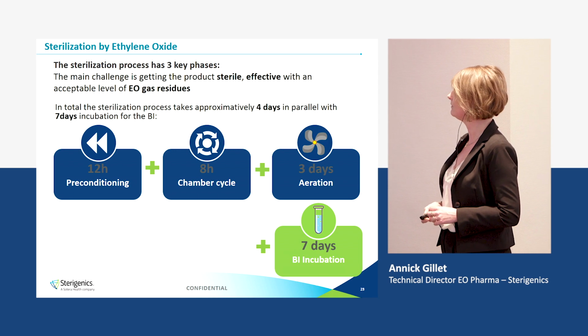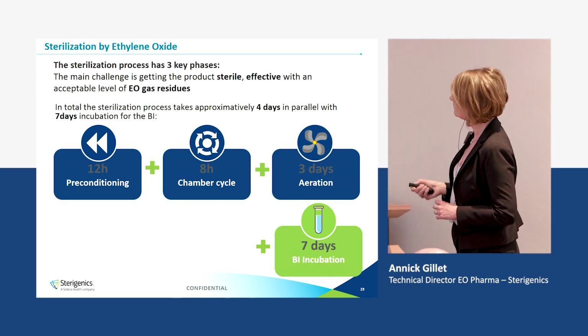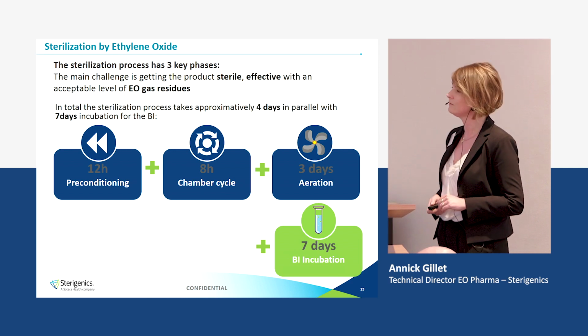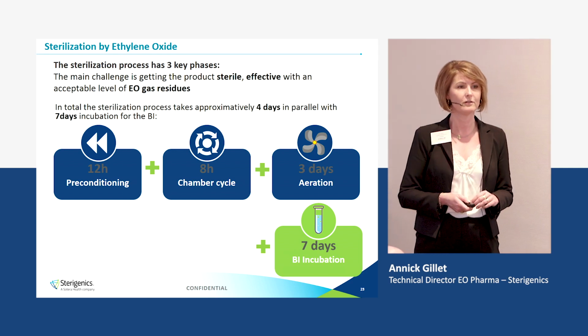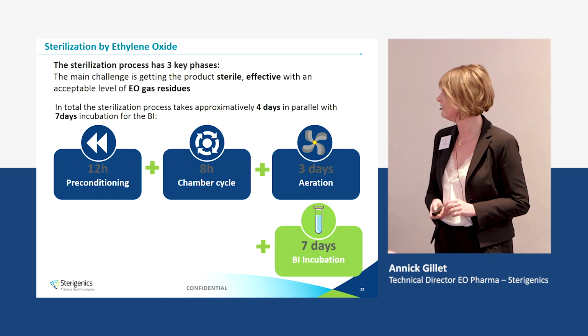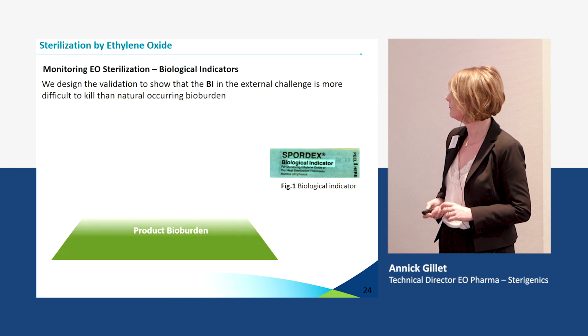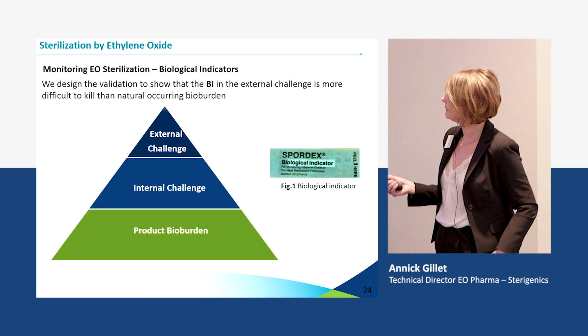3 phases: preconditioning, cycle, and aeration. And in parallel, we are using some challenges. So for the biological indicators that are incubated for 7 days, here is an example of a biological indicator.